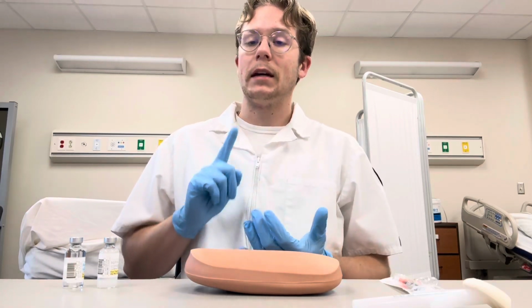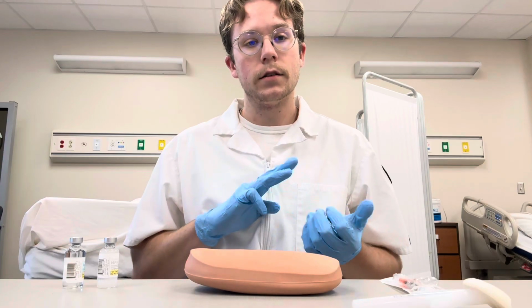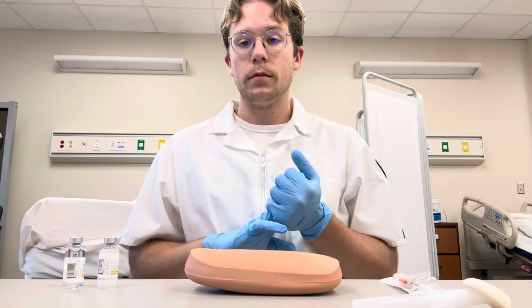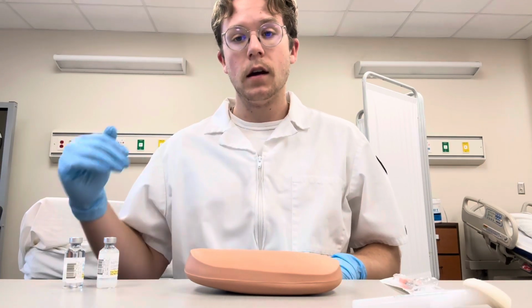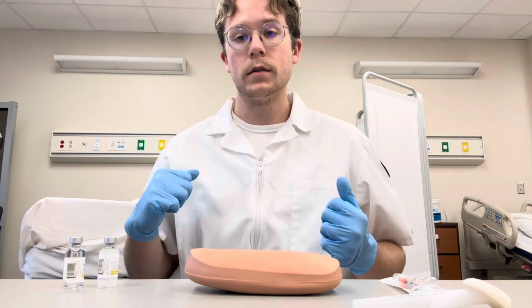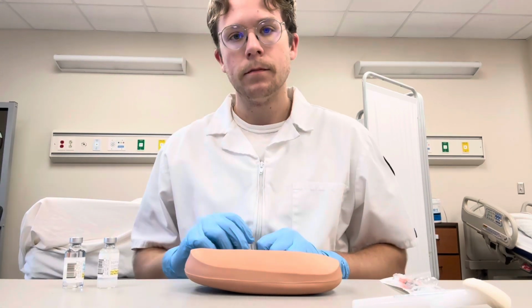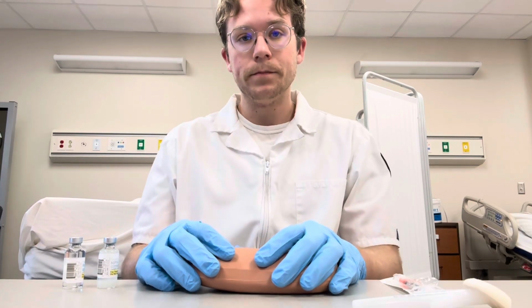Now, insulin can be given several ways: via insulin pump, inhalers, syringes, pens, and it can also be given sub-Q or IV. Some sub-Q sites would be the buttocks, abdomen, the back of the arms, any high fatty areas. But for this video, we'll be going into the patient's right abdomen.